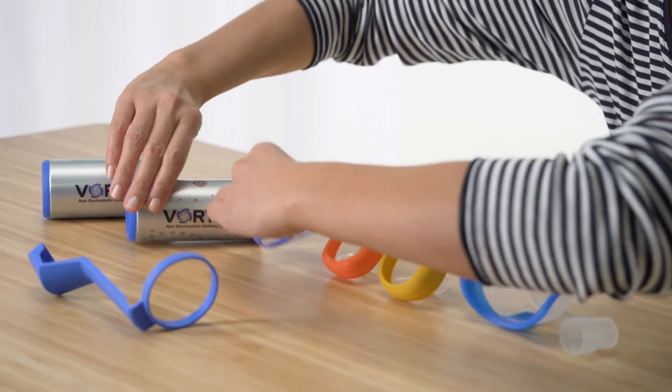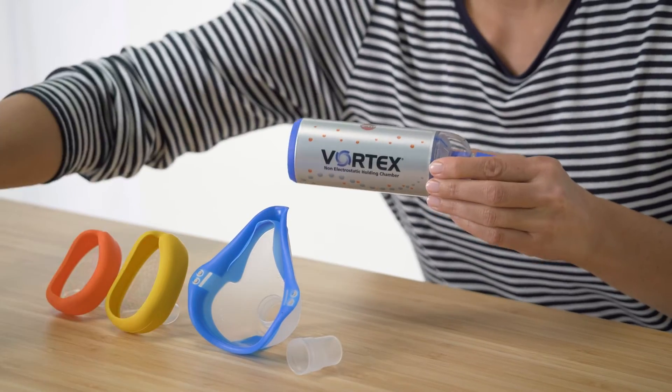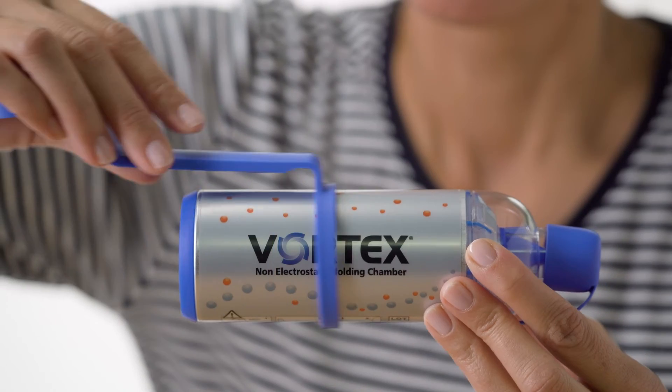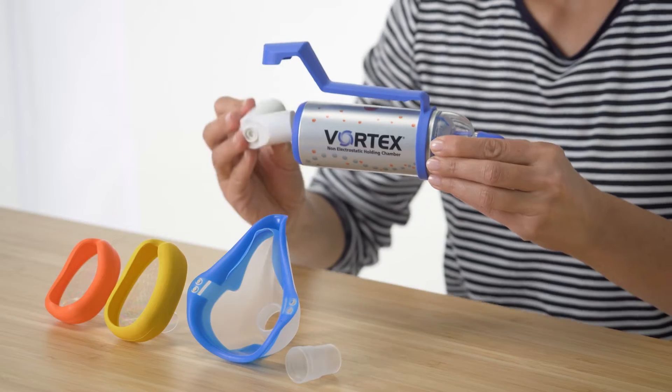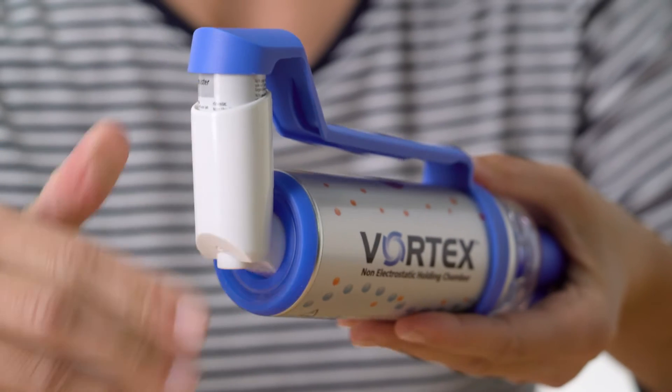First, slot the mouthpiece onto the aluminium chamber. If you're using a one-handed operation aid, push it from behind onto the Vortex as far forwards as it will go. Now twist the metered dose inhaler onto the connecting ring.